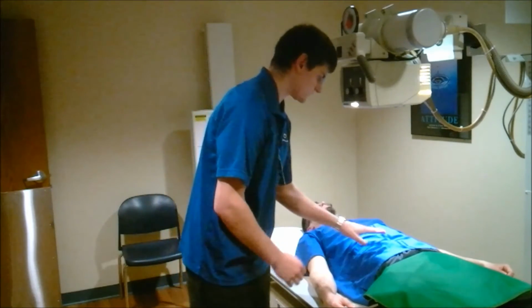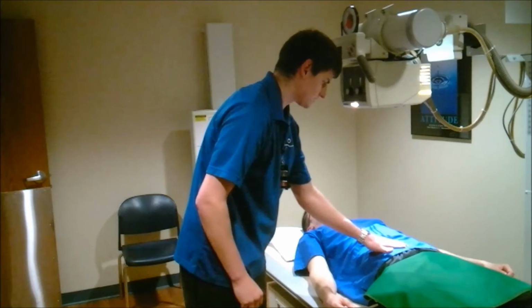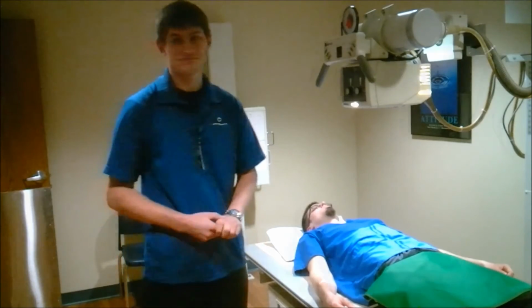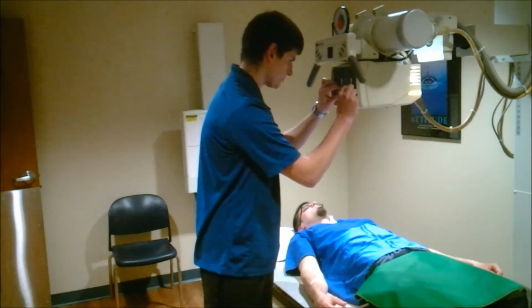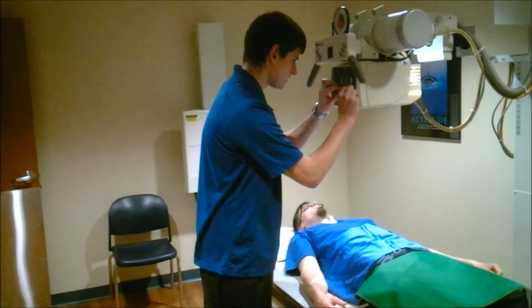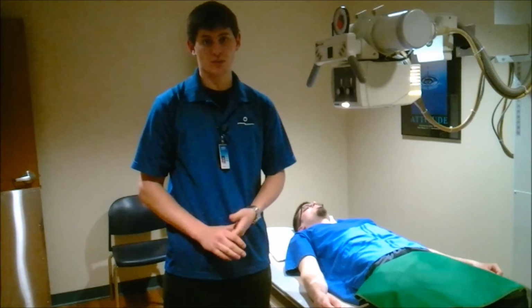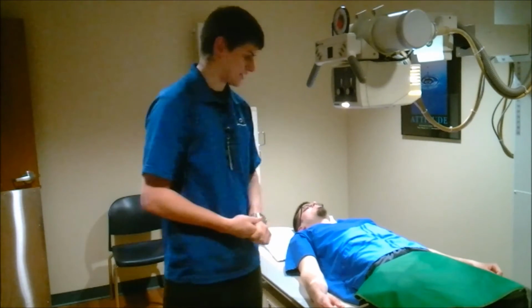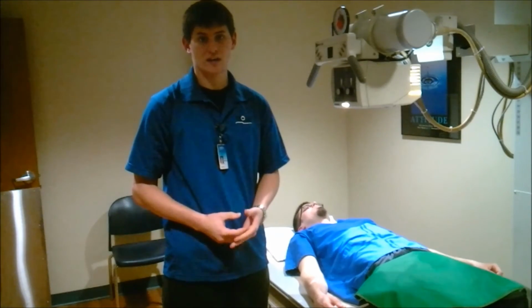We want to simply palpate for the symphysis pubis, just a small palpation. There, we found it. For this projection, we want to open our collimation to a 14 by 17 lengthwise to the part, and we want to leave the collimation open as to not cut off any pertinent anatomy. So next we're going to have the patient take a breath in, blow it out, and hold it out.